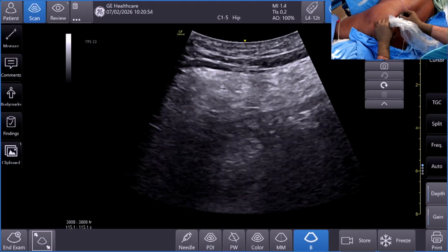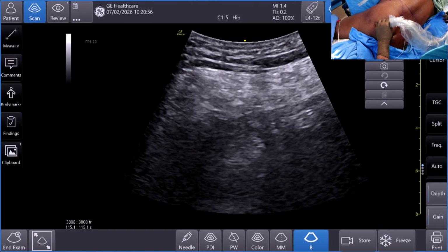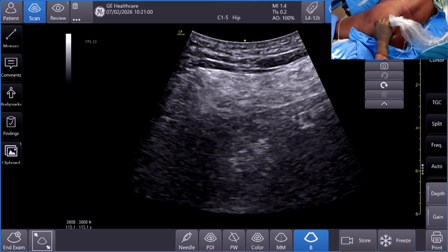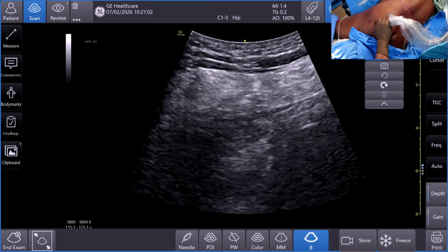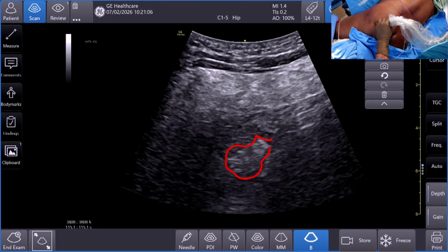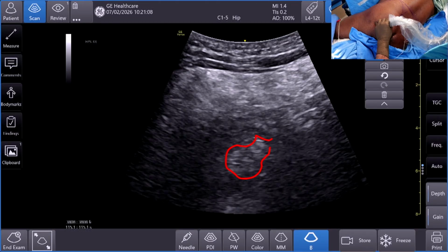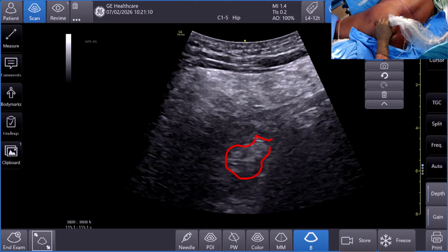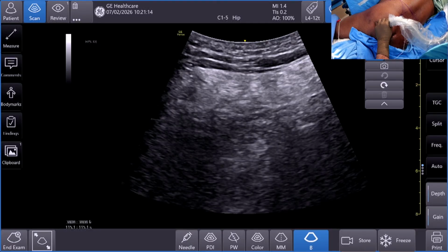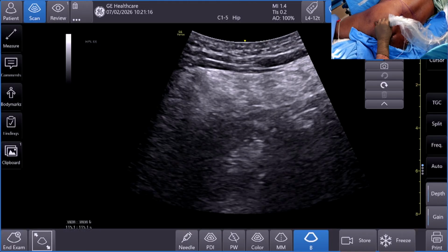You don't see the needle as well as you'd like, but you can see the sacral plexus. So the sacral plexus is lying here. Can you point out with your red marker? Yes, he is marking. That's the sacral plexus. You can see that it's almost like it's dividing at this point into two structures. So probably there's a high division into the tibial and the peroneal components.